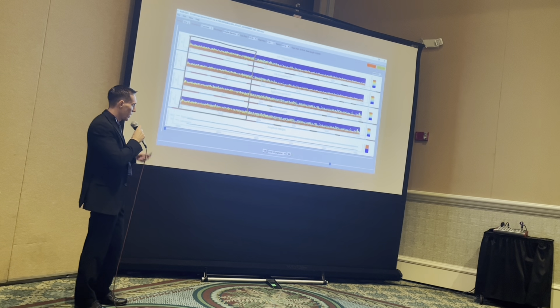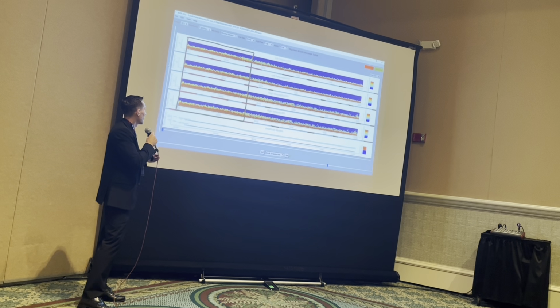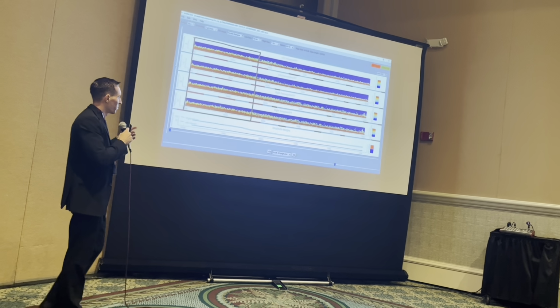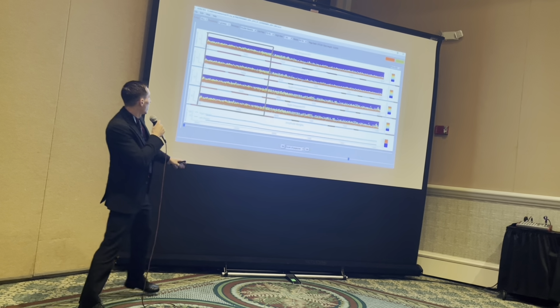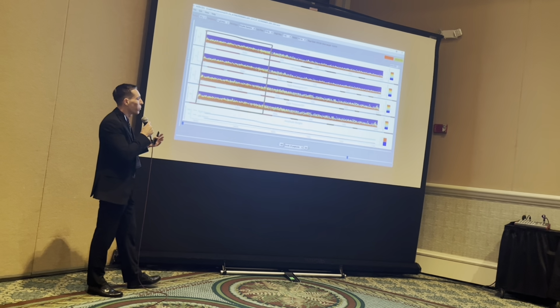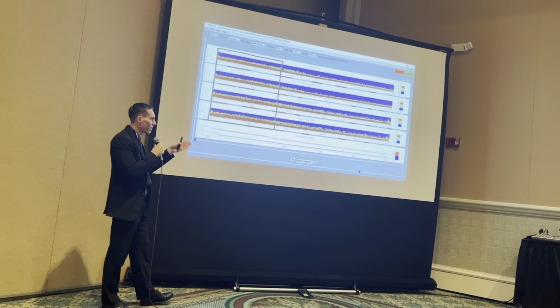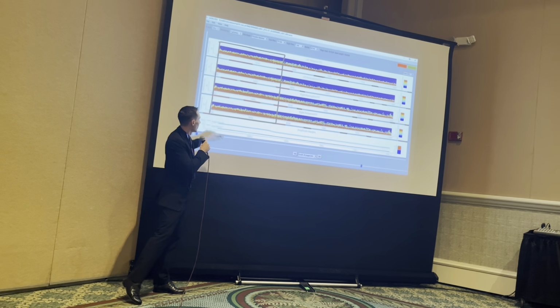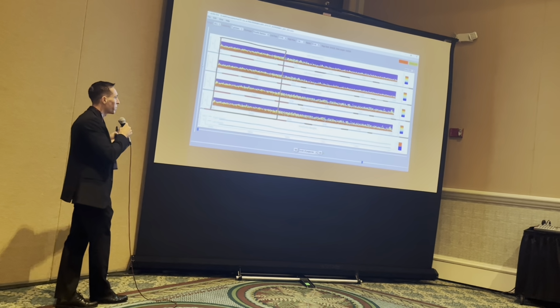Now in this example, the background starts out, in this area where I drew a box, as a rhythmic delta theta pattern. There are intermixed sharp waves. When the redness goes all the way up to about the high theta range, that's known as a broadband pattern. You can see this in patients who are having consistent periodic discharges. So there's a very consistent look to this. The red goes all the way up into the high theta range. It's called a broadband pattern.